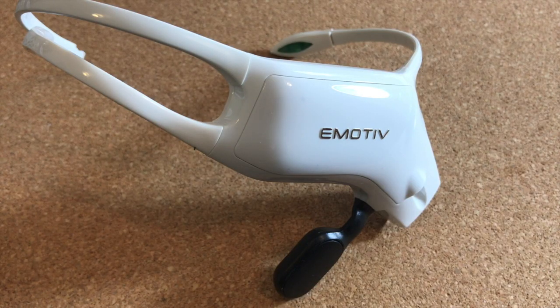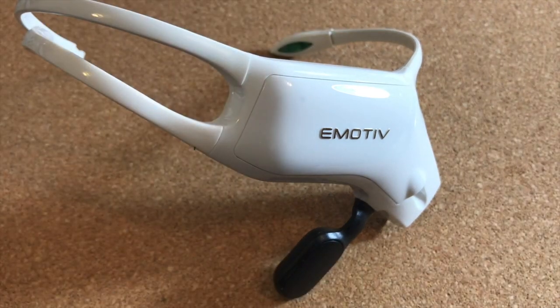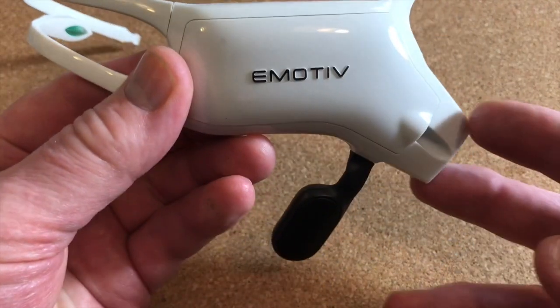Hi there, this is Fixed It. In my last video I showed how to make a power connector for this Emotive Insight headset, and I've been using it despite the fact that it's missing one of its arms and nobody makes a replacement.